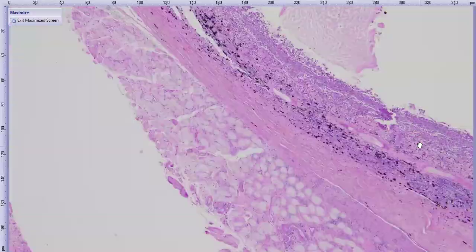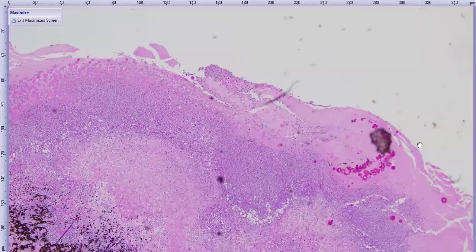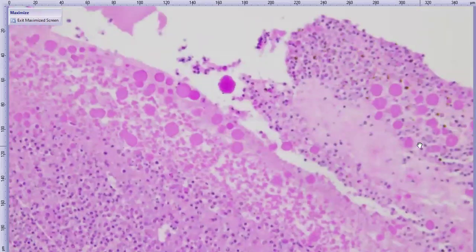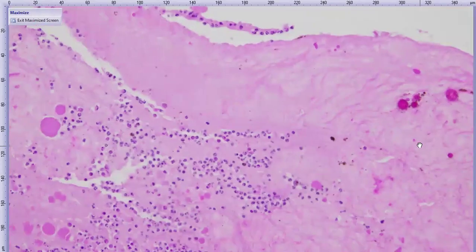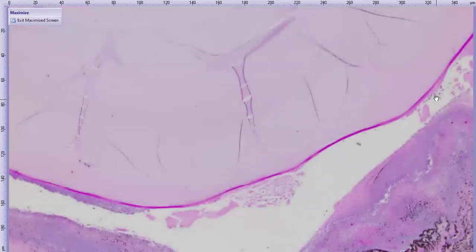And lens protein typically does not stain very brightly with a PAS stain. Yeah, and I'll show you that. So here are the asteroid bodies being all bright and pretty, and then that area with the lovely ribbon of lens protein, they look less bright pink. So yeah, actually there's a nice asteroid body to compare. There are nice asteroid bodies next to lens protein, sort of. There we go. Now they're in the same field. Lens protein, asteroid bodies. All right, I think that's everything that I wanted to show for this case.